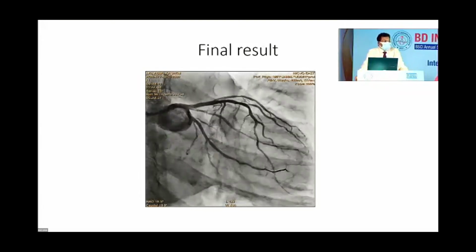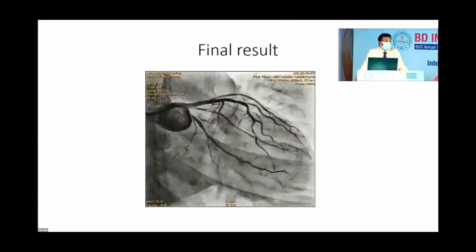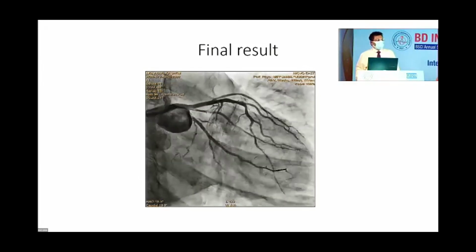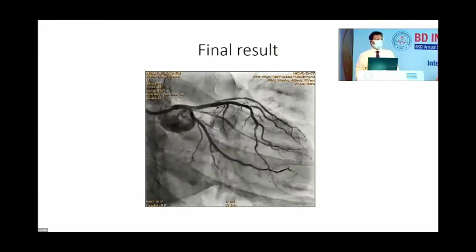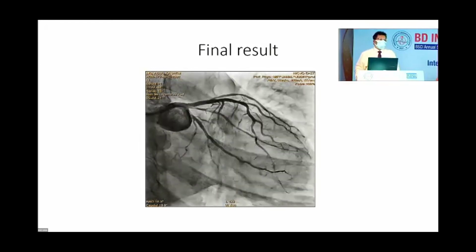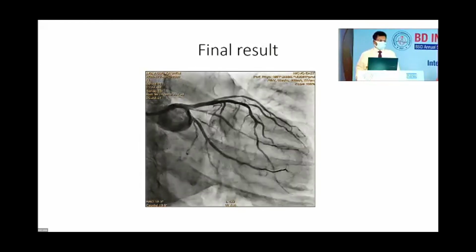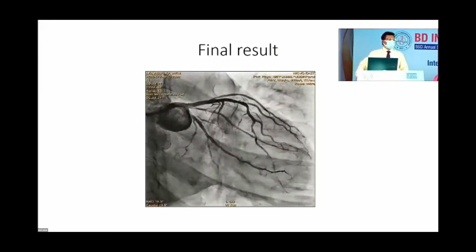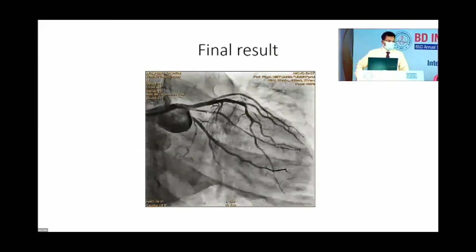That is why it was very difficult to pass anything hard through this hanging part. I could inflate and dilate it, but I could not introduce the IVUS catheter, and I could not introduce another stent, because there is a hanging part, like a hanging shard. Through this hanging shard, how shall I enter with a hard thing?